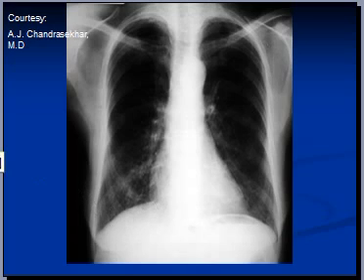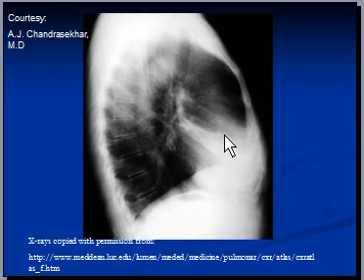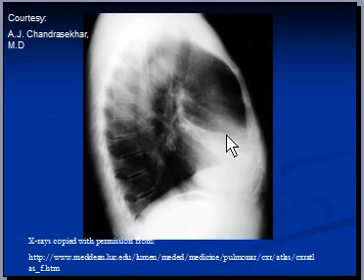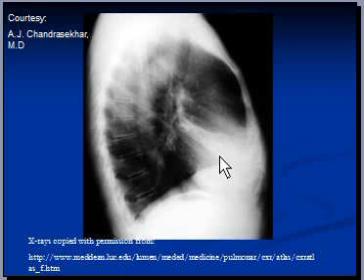On the lateral film, the increased opacity from the collapsed lobe is often easier to see compared to a PA view. The displaced horizontal fissure and oblique fissure, and the opacity between these two fissures because of the absence of air, make a clearly visible triangle which you can easily see.